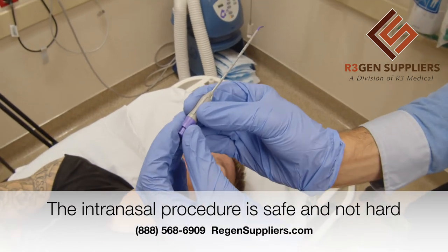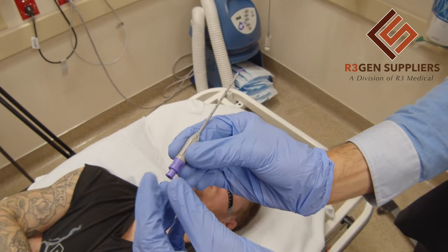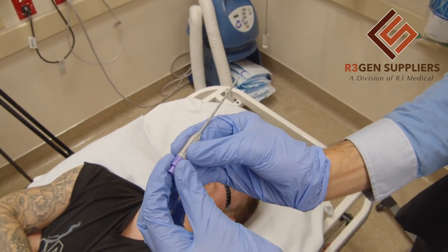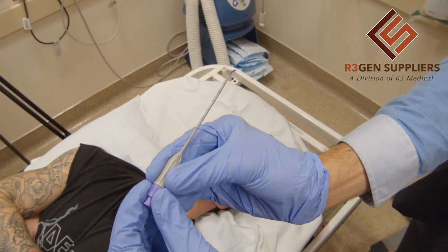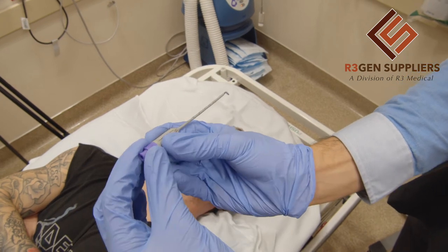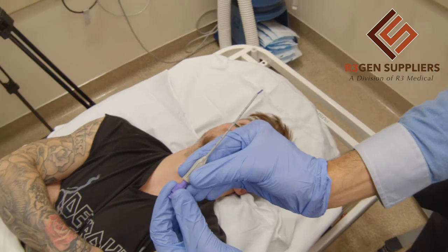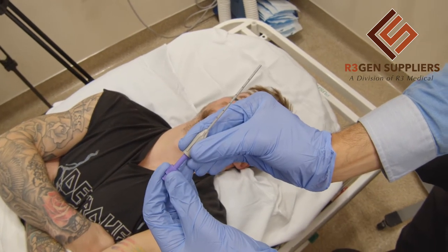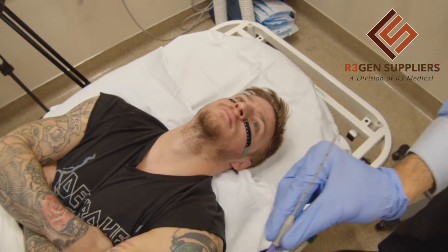It's really important that after we inject the stem cells, we don't pull out the entire SpinoCath device directly outside, because we can cause damage. What we want to do when we're inside and done is pull in the little probe first, and then pull it out. It's really important to do it like that.